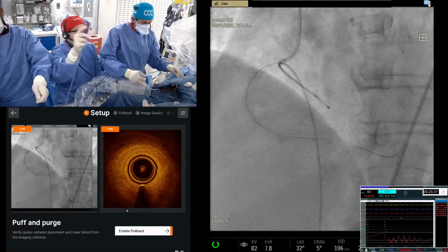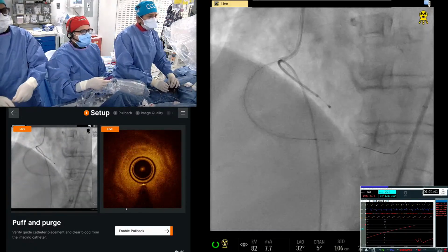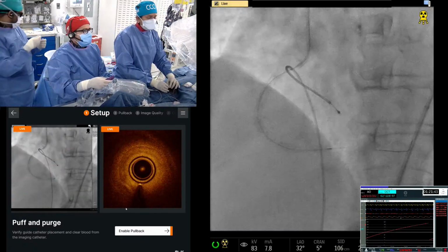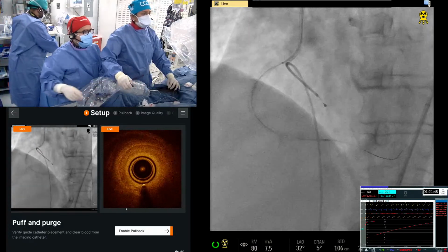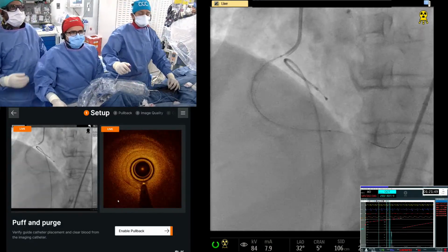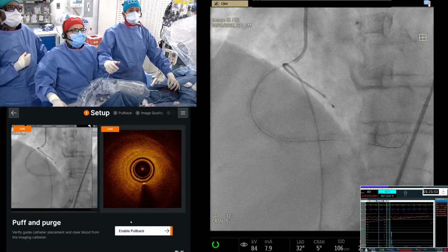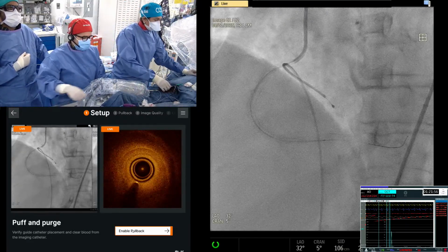Take 4 Ps. I'm going to pull the guide out a little bit, okay? Let us see how it looks. Okay, good. Yeah, we can try one second. Are we good? Okay, clearance, because we pulled the guide out a little bit. But we can try.